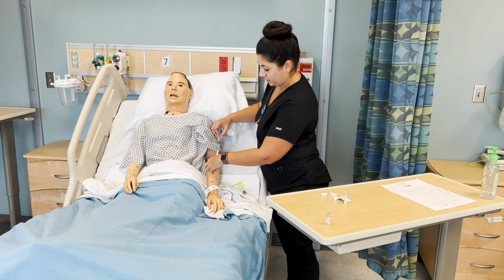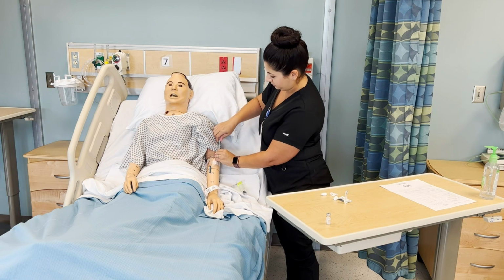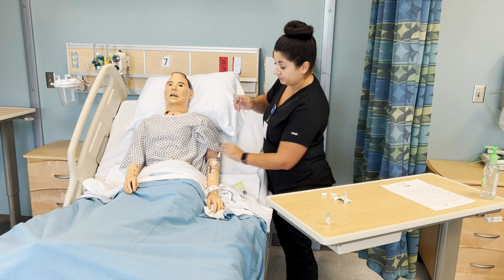Make sure to clamp your IV. And that's it.